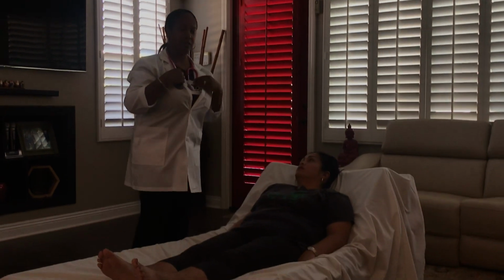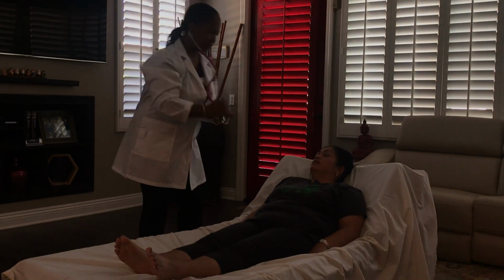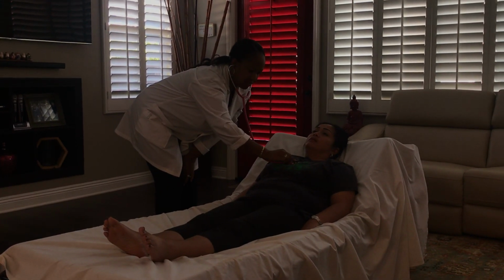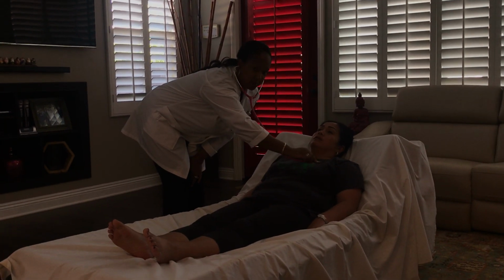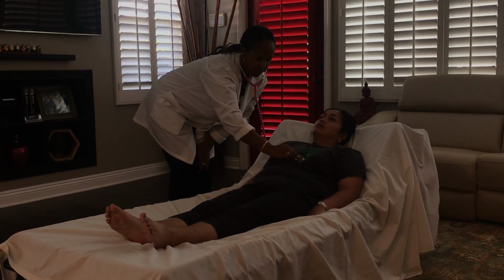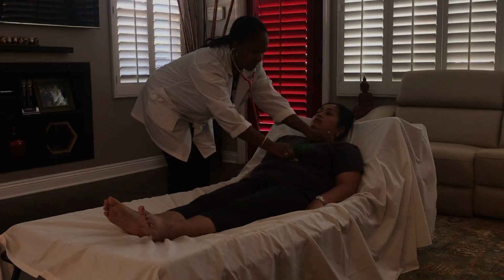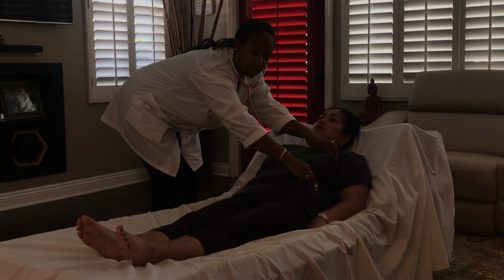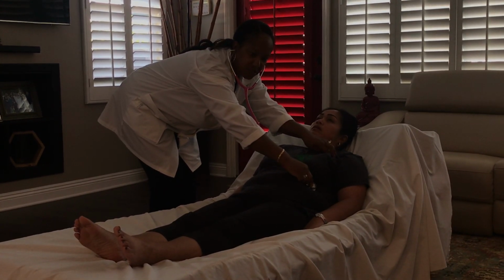Next, I'm going to listen to the areas I just palpated with both the bell and the diaphragm, starting with the diaphragm. Right sternal border, second intercostal space. Left sternal border, intercostal space. Moving down to the third, fourth, fifth, again, which is Erb's point. And then going to mid-clavicular, fifth intercostal space. Again, listening for any thrills or pulsation.